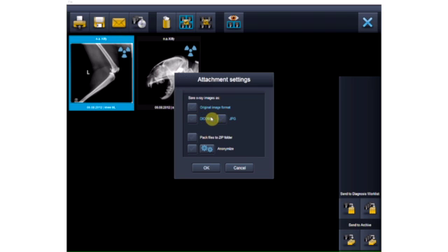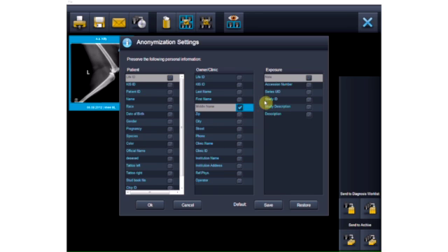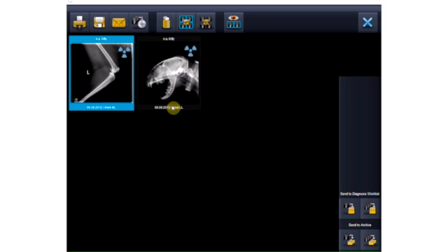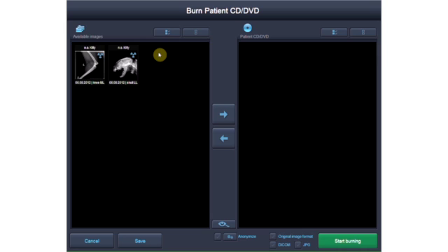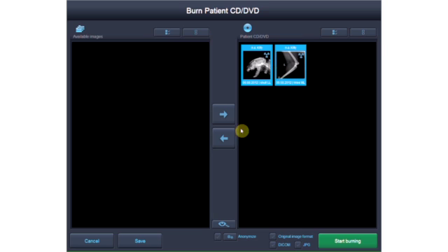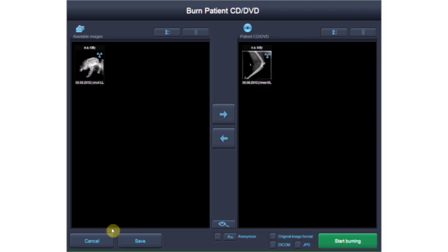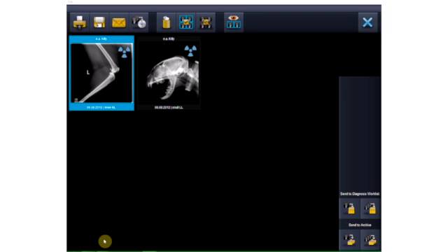You can send the images by email directly from the Examion AQS software, and here too you can anonymize the images. All the data you select and mark are noted on the image. You can also anonymize the images and burn them to CD or DVD in the desired format, a quick and intuitive procedure. In addition, you can delete the selected images from the thumbnail overview screen, send them directly to the diagnosis worklist or the archive, or start the viewer directly.